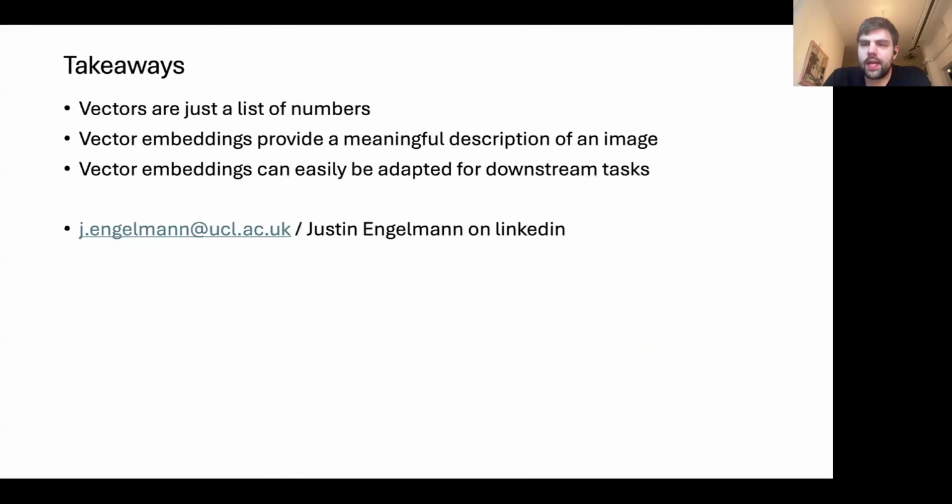There's often this idea that we need larger models, but actually I think we want models that more densely and more meaningfully pack information into the vectors. If we could have a vector that's just 60 dimensions, but captures everything we would ever be interested in in ophthalmology, I think that'd be great. So there are smaller models, and having both smaller, more efficient models, and models where the representation has a higher quality, is very important. You can probably find the preprint on arXiv, and the model is already available. If you have a chance to take a look, please do let me know.